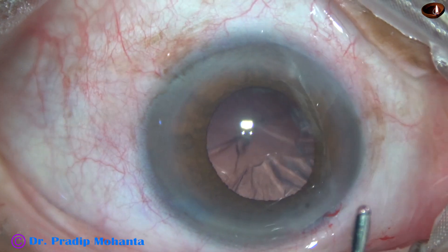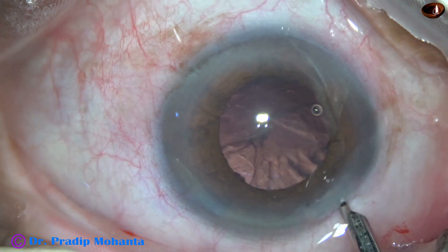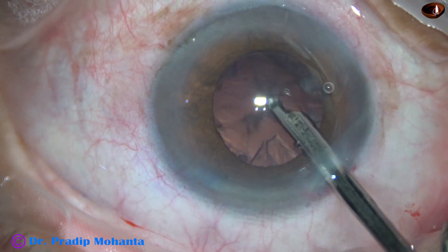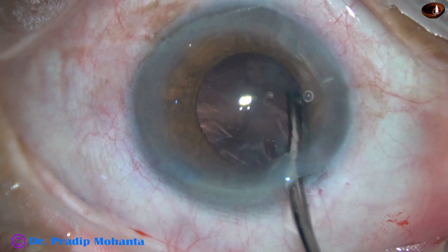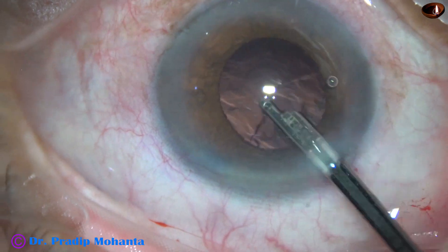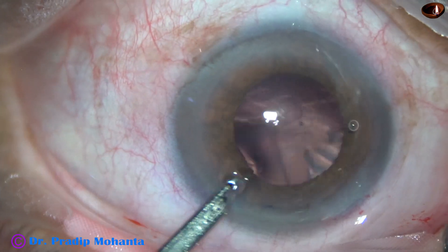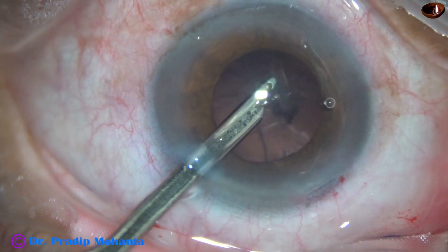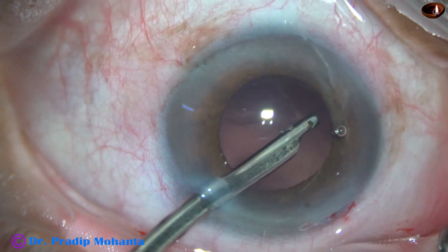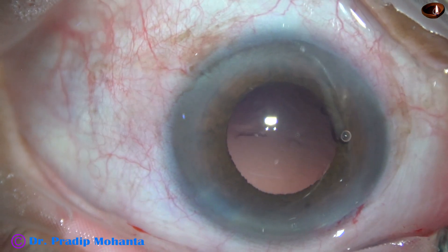Now I come out. Since I have made only one side port, my plan is to use a 23G Simcoe cannula for removal of the cortex. The trick is to elevate the anterior lip of the main wound slightly to balance inflow and outflow so that the anterior chamber is maintained. Most of the cortex is removed. Now I remove the sub-incisional cortex going through the side port. This single side port is about 1.7 mm — had we made two side ports of 1.2 mm each, that would have been 2.4 mm total, so this single port is actually less.